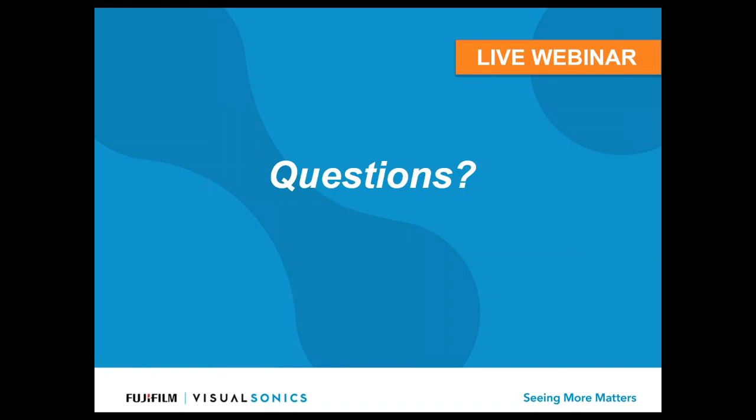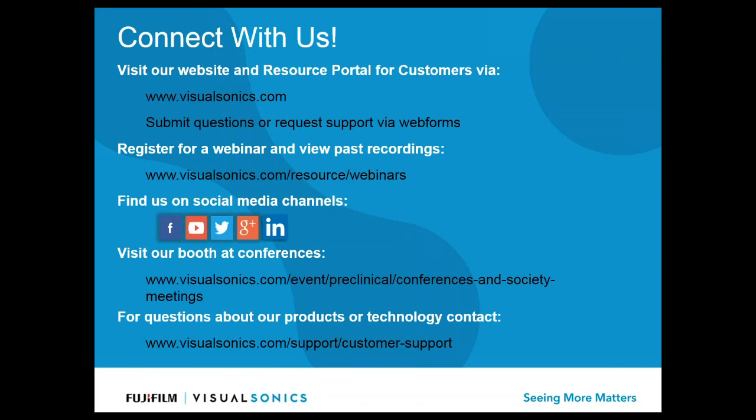Yeah, okay. Definitely, I concur. That's a really good point. The system gain is a really important point to try to standardize, to keep it consistent. Sorry, we actually took presenter rights back just before you mentioned that last slide. So for anybody that was wondering, just refer back to that summary slide that Sandra showed that has all the papers on it for that paper that she was mentioning.